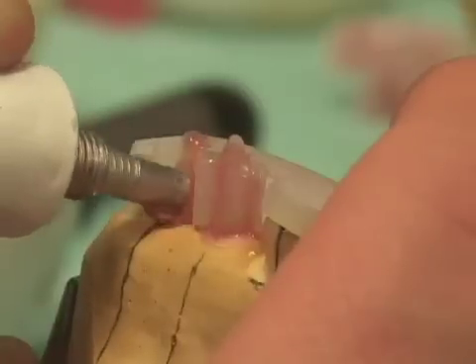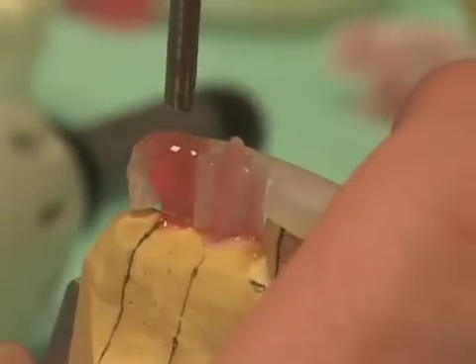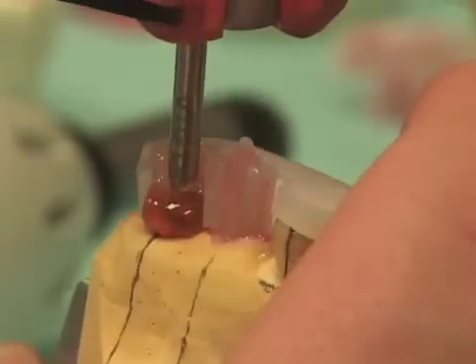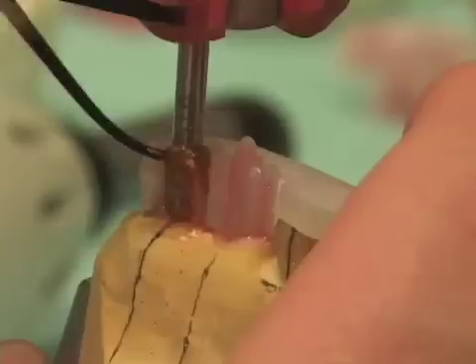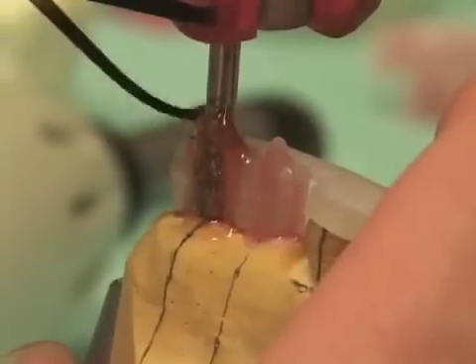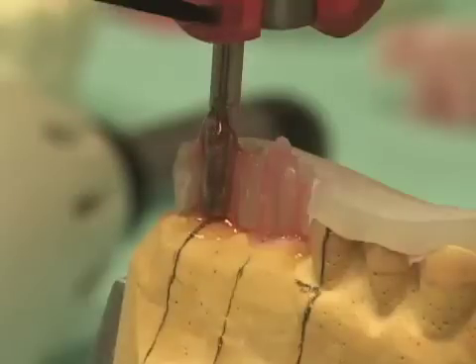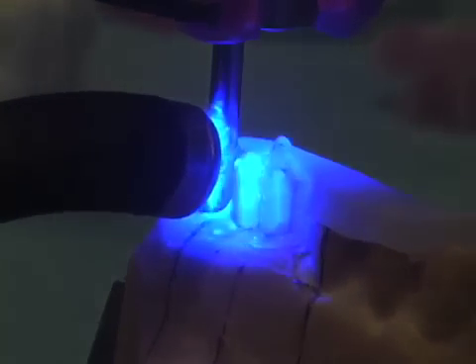We're placing our triad gel at our second location, and here again I don't rotate this at all. I lower this exactly straight down, because I had pre-positioned it. This camera angle shows fairly nicely how the triad gel will slump at the buccal, and you can use the Peter K. Thomas instrument for coaxing and teasing the triad gel back up around the drill blank. I don't care if the buccal has any material on it, but I want it well adapted at the lingual 180 degrees. I'll cure this 20 seconds each side and go off camera, then come back for our final trimming.